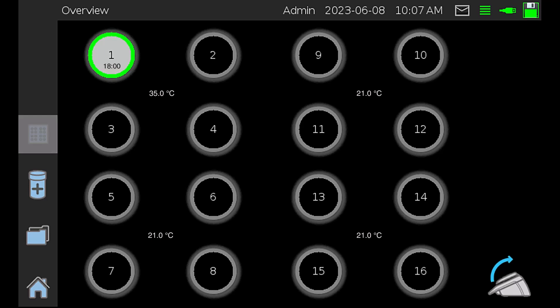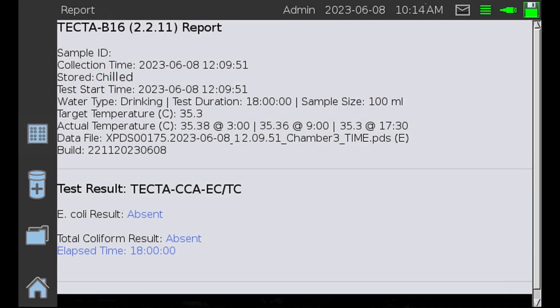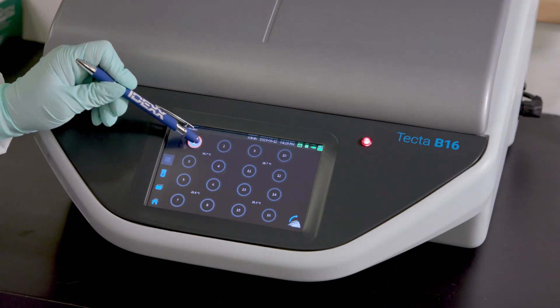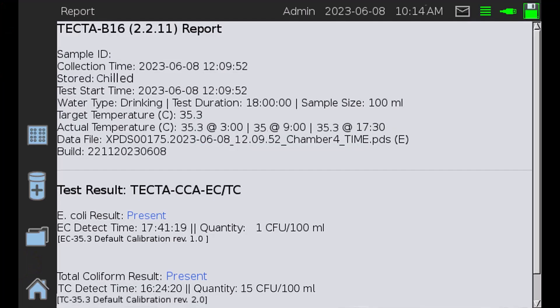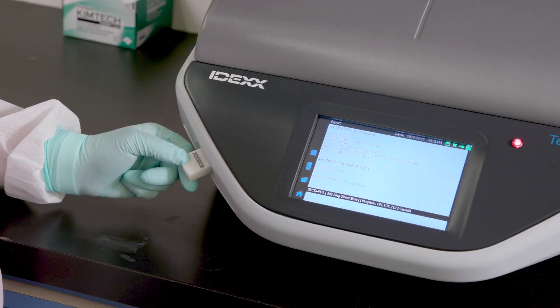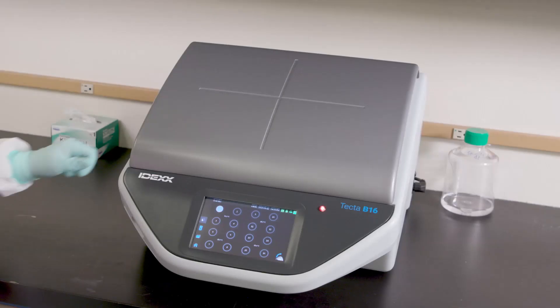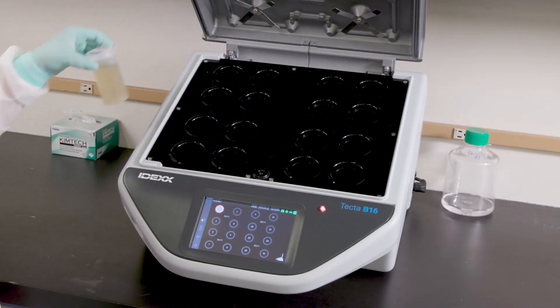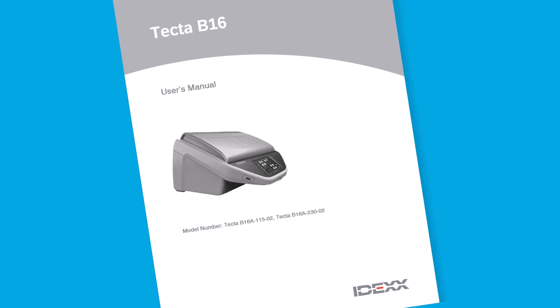If target bacteria are not detected by the end of the test run, a green circle will appear around the chamber indicating the test is complete. When the test is complete, a report will be available on the instrument. If the TECTA is connected to the internet, a report will also be sent to all email recipients configured in the email tab. Test reports can also be downloaded as CSV files using either of the USB ports located on the instrument. Once the test is complete, open the lid and remove the cartridge. You will find the quality control procedure in the product insert.